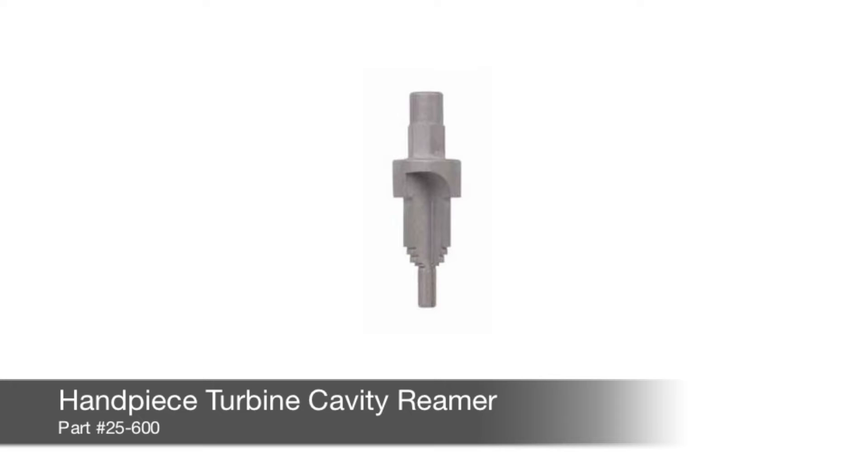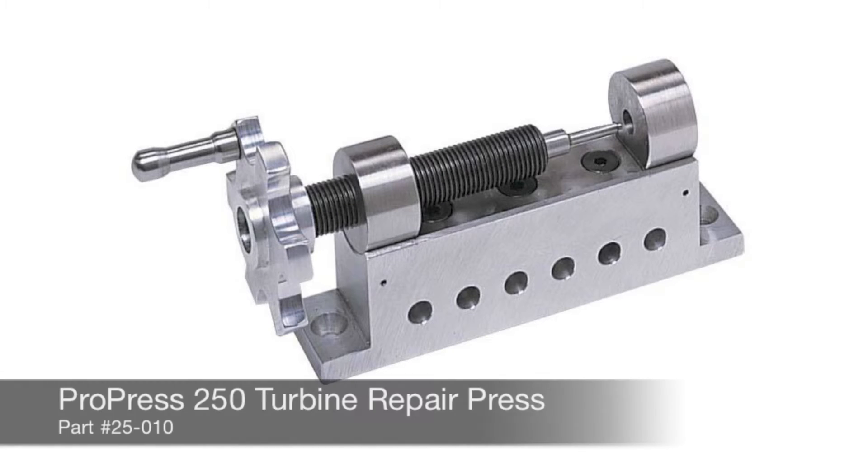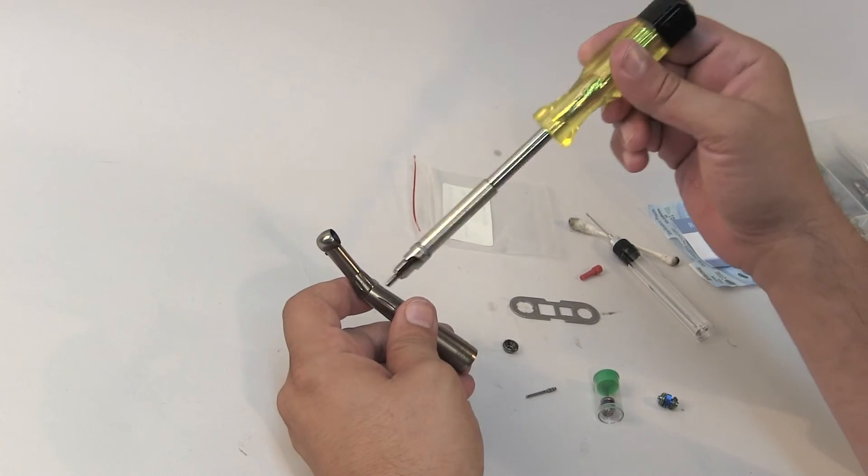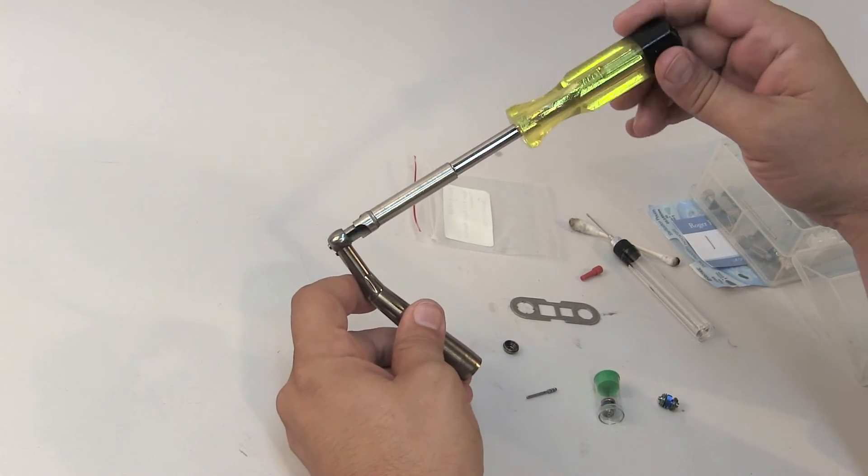This tool also works to remove stubborn debris from the turbine cavity and can be used with our ProPress 250 turbine press, a quarter inch socket wrench, or by hand tightening as can be seen here.